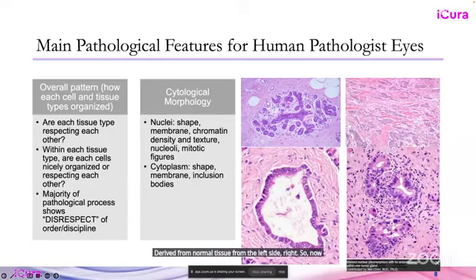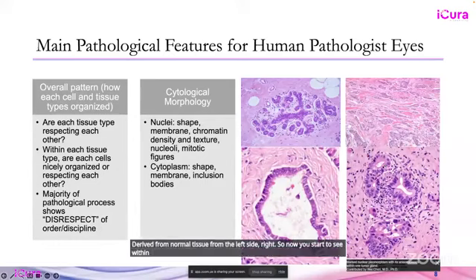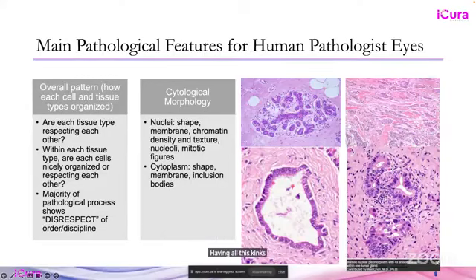So now you start to see within the so-called gland, the shape is very weird. You can tell some of them are forming a network. Some of them are having all these kinks and abrupt changes, almost forming an angle. And these are definitely not the right structure.